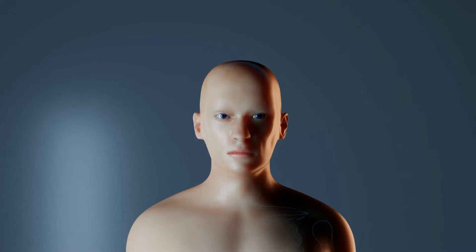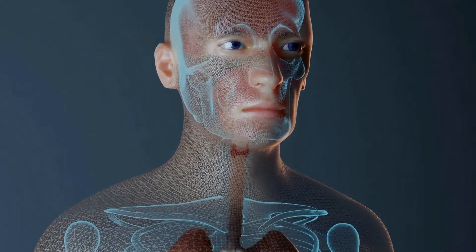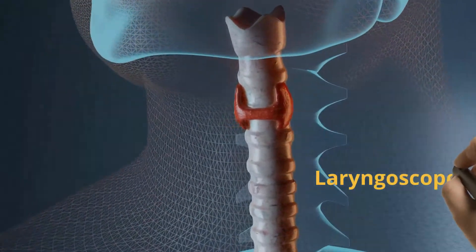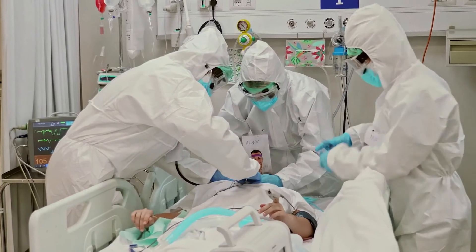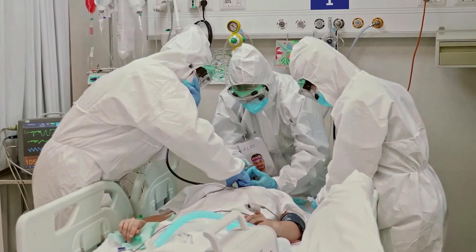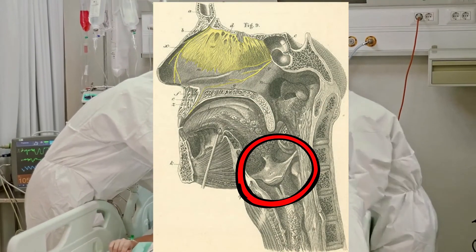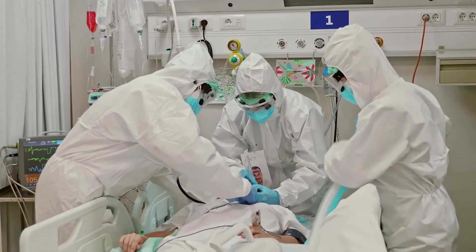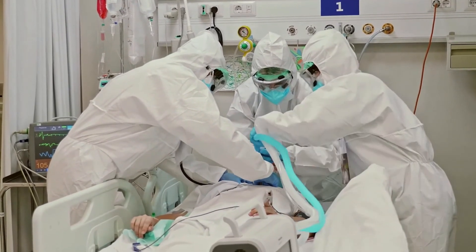With this combination, the person will not be aware of the breathing tube being placed. The breathing tube is placed with the help of an instrument called a laryngoscope. With the person lying on his or her back, the laryngoscope is inserted in the patient's mouth to get a view of the epiglottis, a structure not visible to the naked eye. Then the laryngoscope is lifted up to get a view of the glottis, through which the breathing tube is inserted.